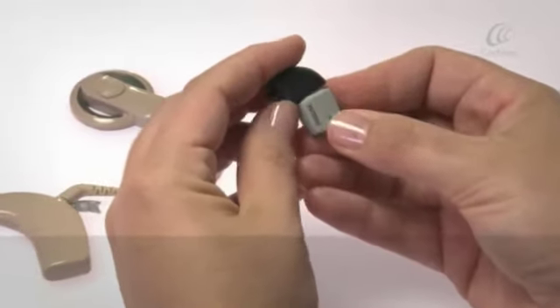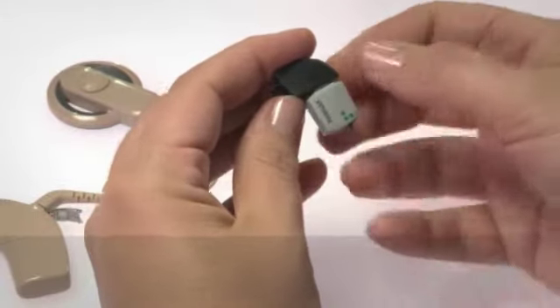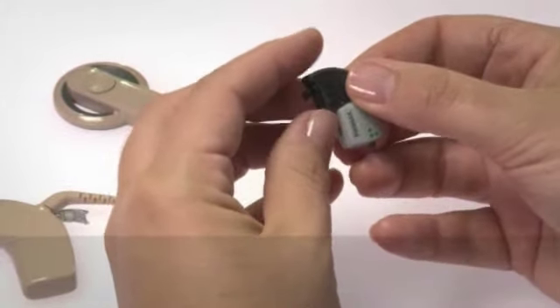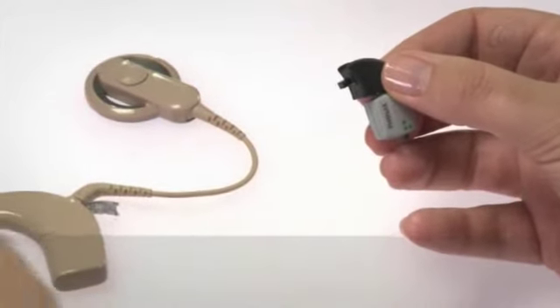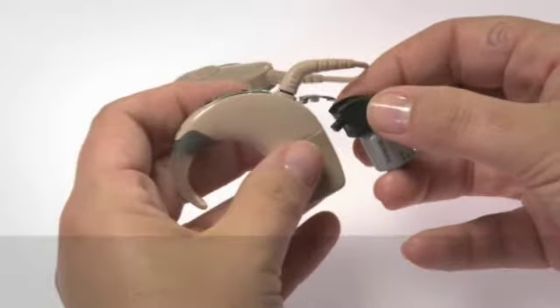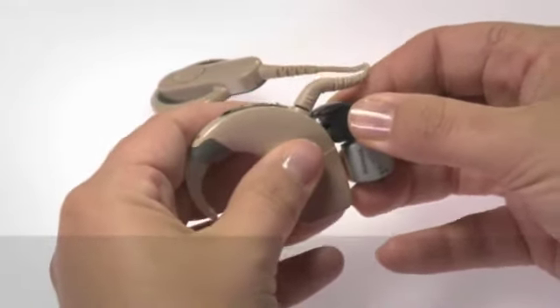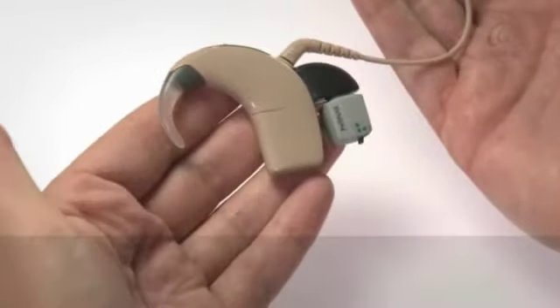You must insert the 3-pin Euro plug into the Euro Accessory Adapter and turn it on before inserting the Euro Accessory Adapter into the CP910 sound processor. The sound processor will automatically detect the FM receiver.